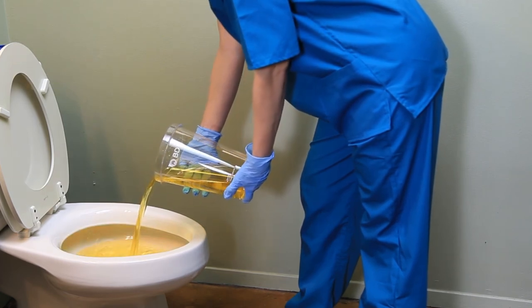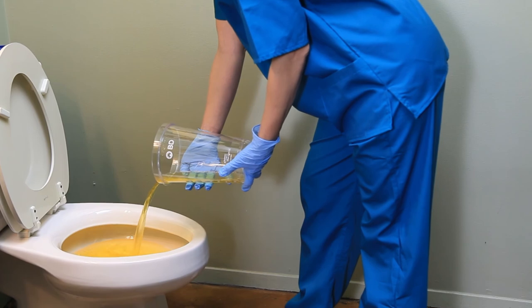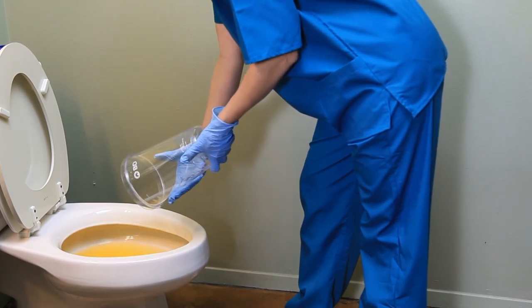Carefully remove the lid and dispose of urine in a proper receptacle, such as a toilet, or according to facility protocol.